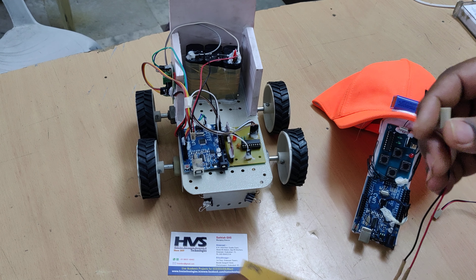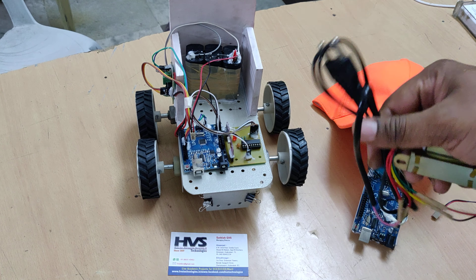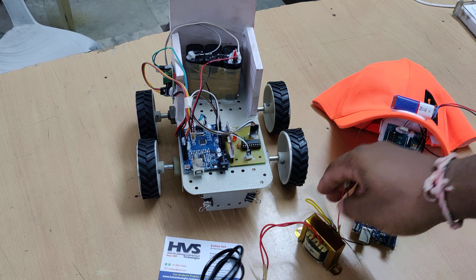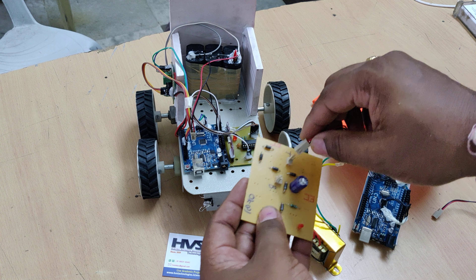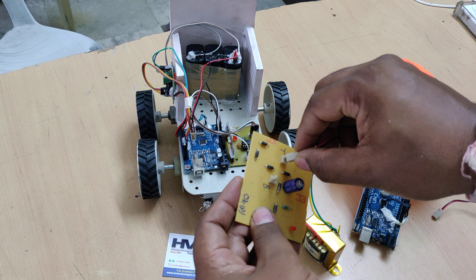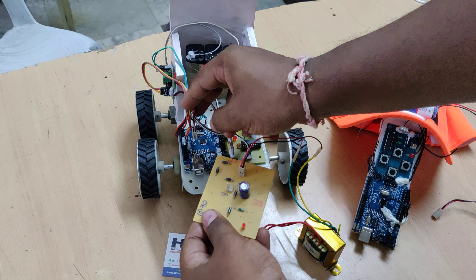We are using a 12 volt 1 amp rechargeable battery, which can be charged using this charger. This transformer takes 230 volts input and provides 12 volts AC output. From the charging circuit we get 12 volts DC. Connect T to the T slot and B to the B slot to recharge the battery.